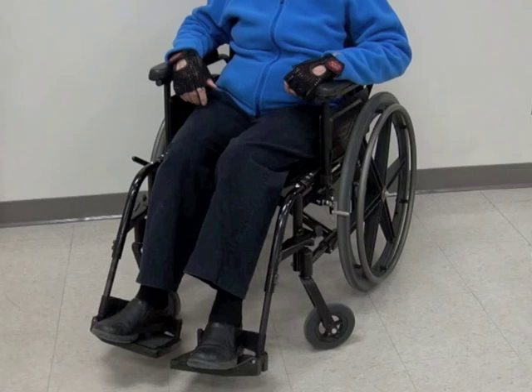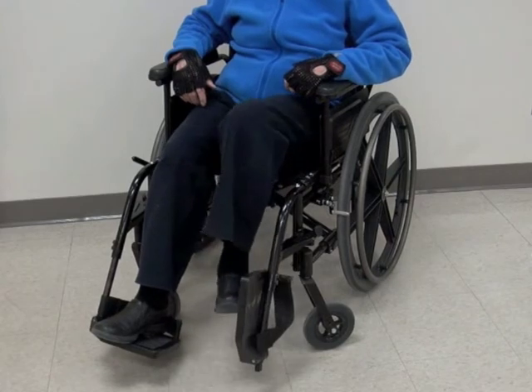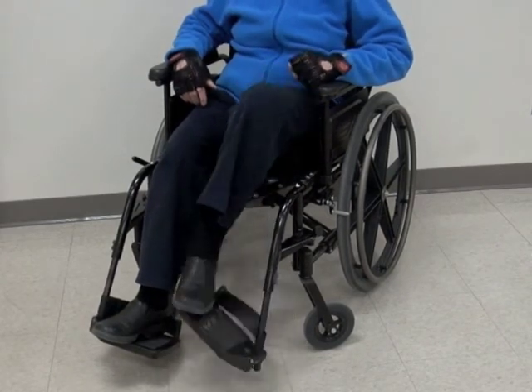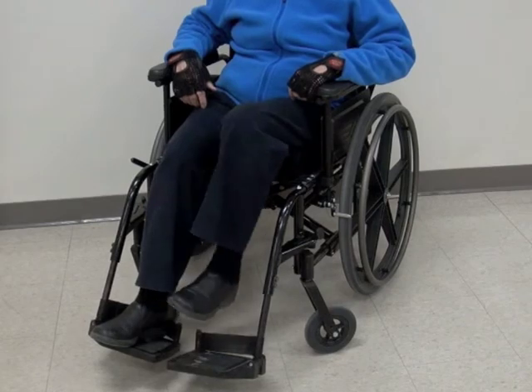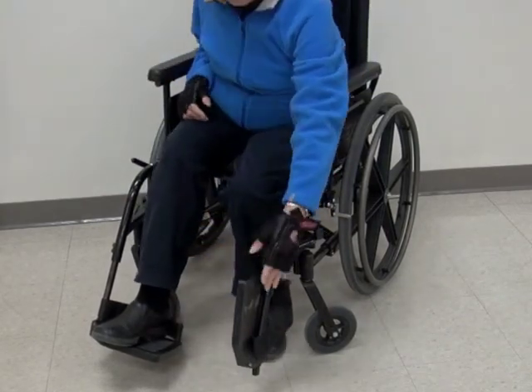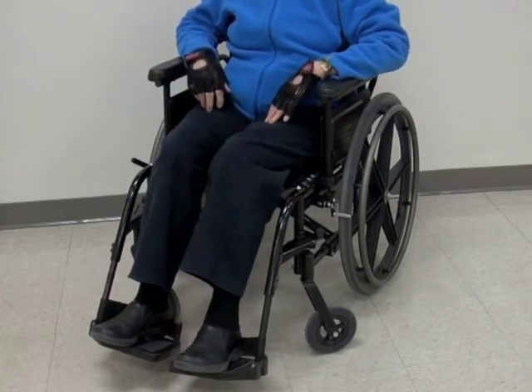In addition to swinging away, the footplate can usually be flipped up. Often, this can also be accomplished without using your hands, by sliding your foot off the footrest, slipping your toes under the footplate, and carefully lifting it up. You can also accomplish this by reaching down with your hand and flipping up the footplate. A well-functioning footplate should remain in the upright position until you use your foot to push it back down.